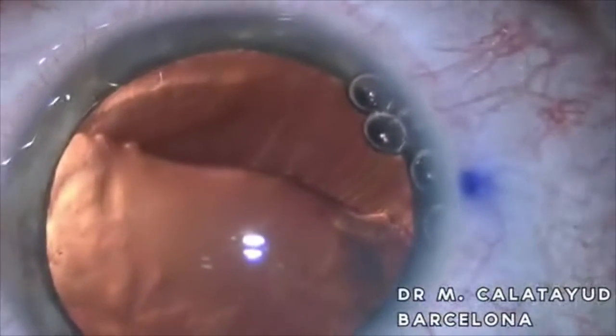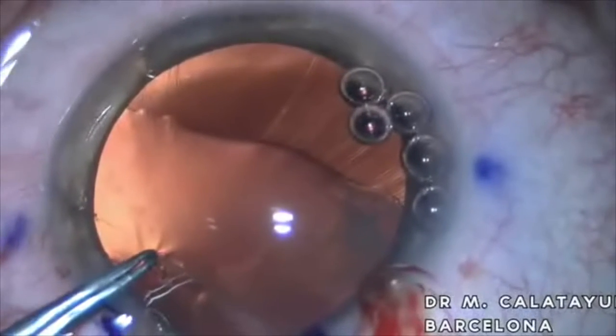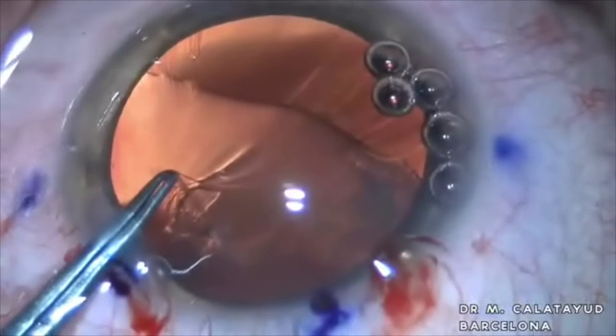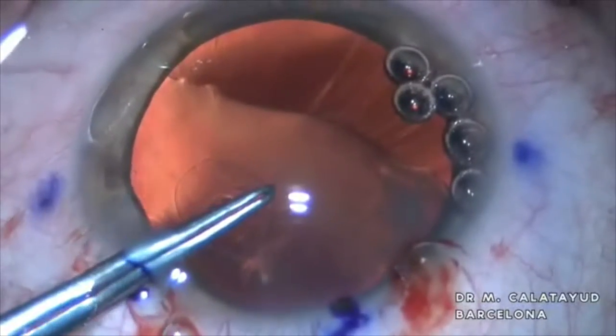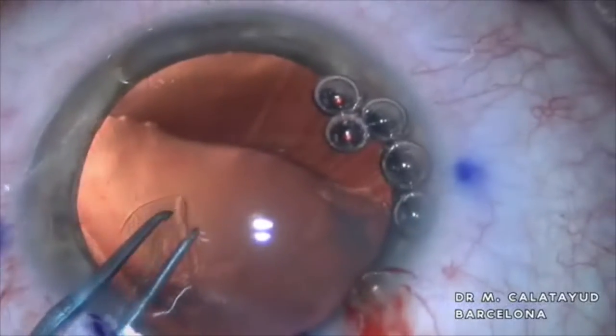The most important step in this kind of surgery is to achieve a complete capsulorhexis. Without it, we cannot implant neither the ring and probably not the lens into the back to get a good visual acuity in the postoperative period.